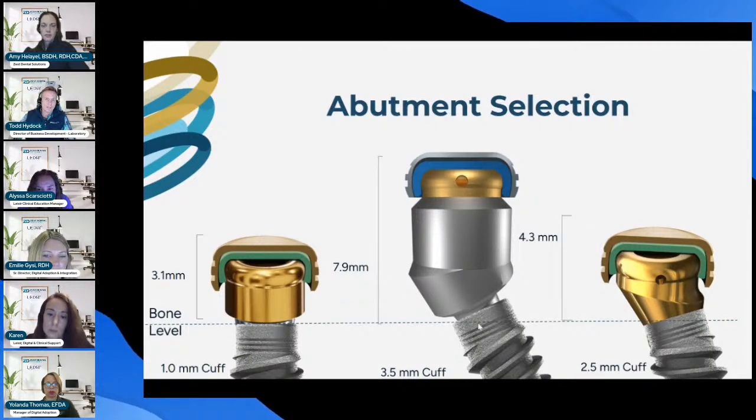The abutment itself has this collar, and then the actual locator piece will screw down through the collar into the MUA. So this is what I was talking about. Now, with the actual traditional MUA, we don't have anything specific that snaps over as a scan body, because we're trying to capture the geometry of the locator, not the actual MUA itself. Yep.